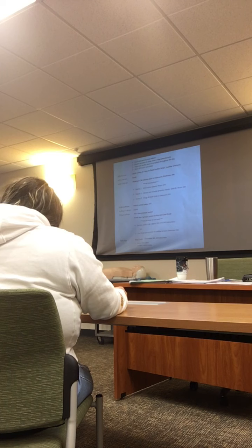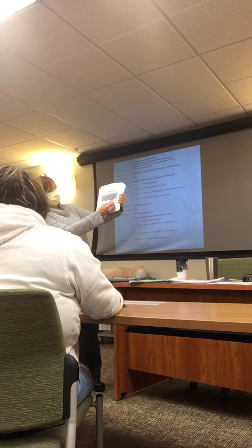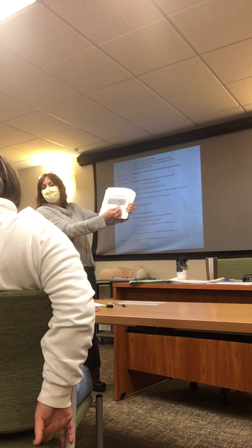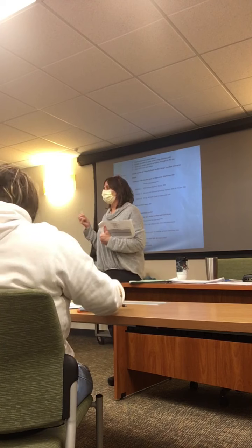Wait, can you go over that part again? I'm confused. Where exactly are we measuring? I'm measuring from the beginning of the downward deflection till it gets back to the isoelectric line, from there to there. So it's very wide, very bizarre. PVCs are known for being wide and bizarre.